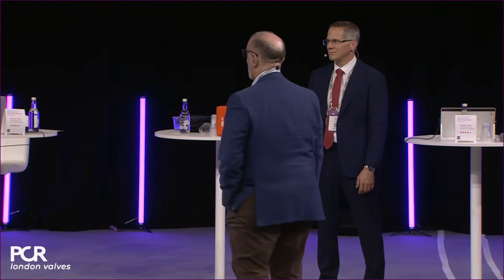Who uses routinely a Lunderquist to do their FX or their Pro Plus cases? And who uses routinely another wire, be that a Safari or a Confida? So I think this is the big difference between the US and Europe. We never really got there, most of us, and some of us did it for particular studies, but I certainly felt more comfortable using a Safari than I realized. So I'm happy that this is a change, that you think it's no longer necessary.